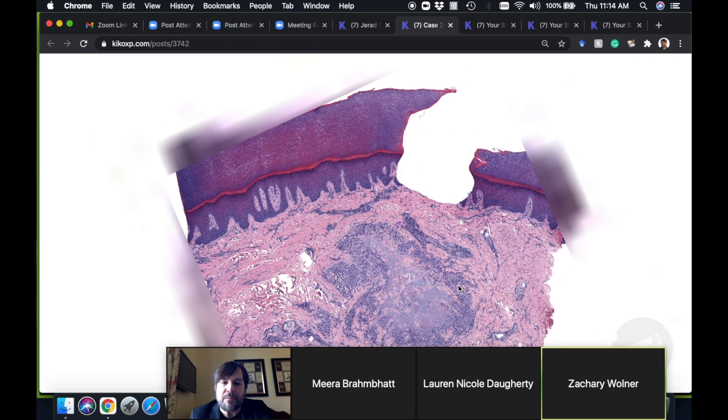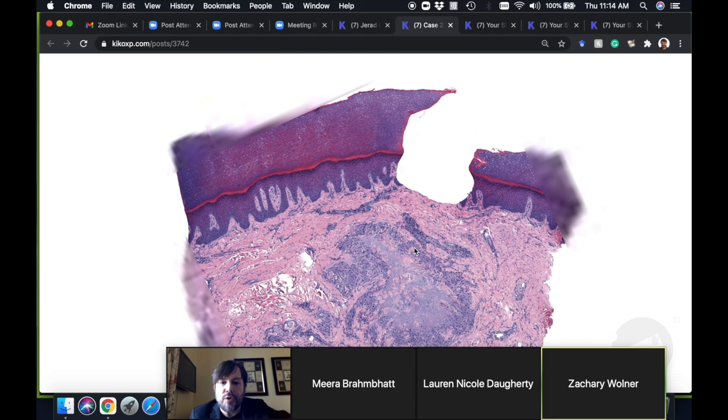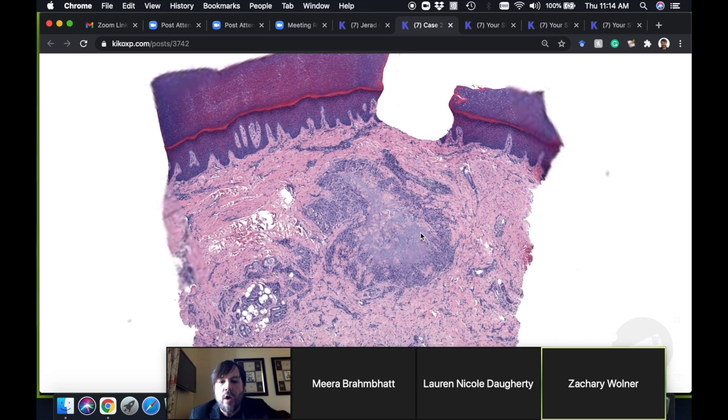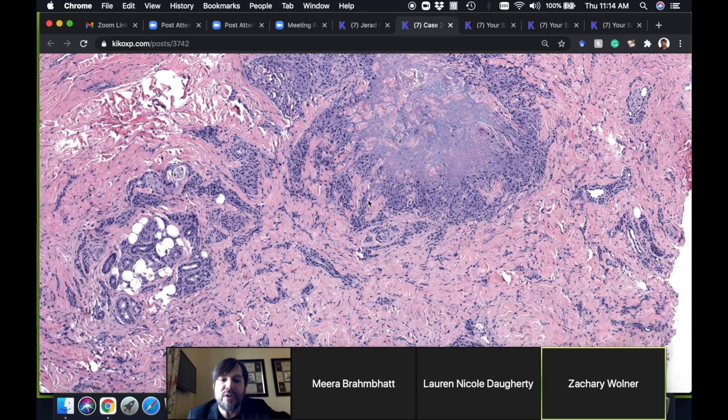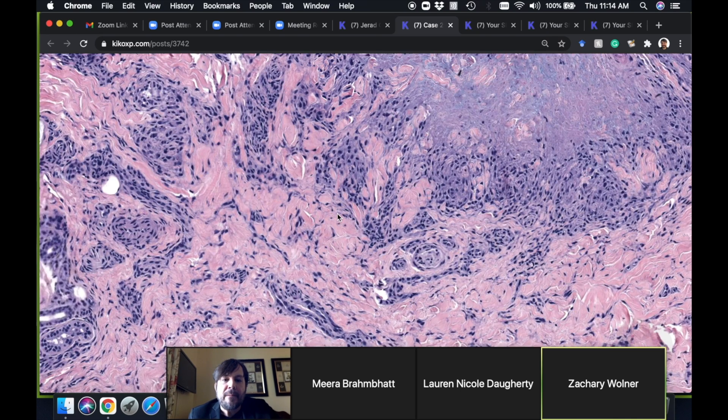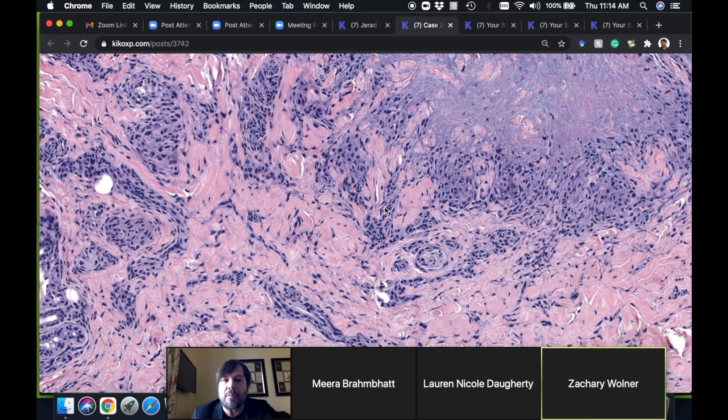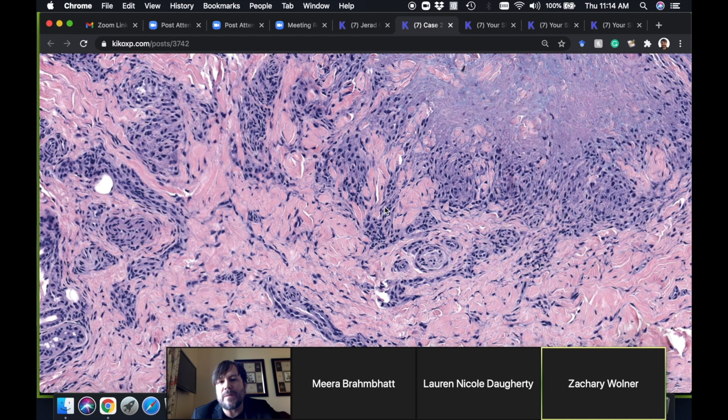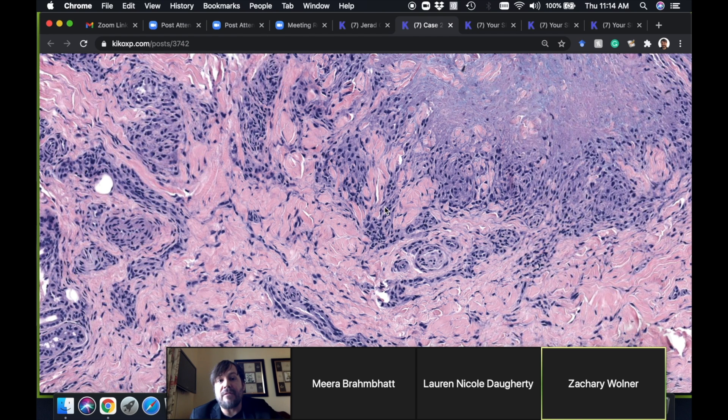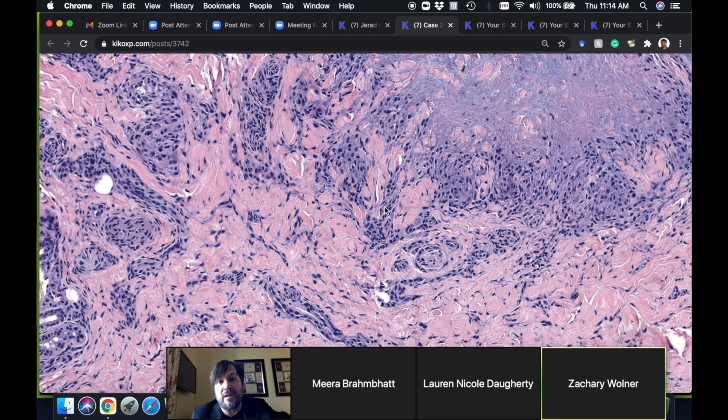The blue mucin is a pretty good clue that you're dealing with granuloma annulare, although sometimes I've seen cases of GA that had fibrin in them. If I recall, the rule is that you can have granuloma annulare with red fibrin but usually you don't see much blue mucin in rheumatoid nodule.